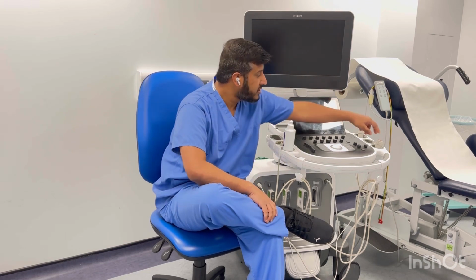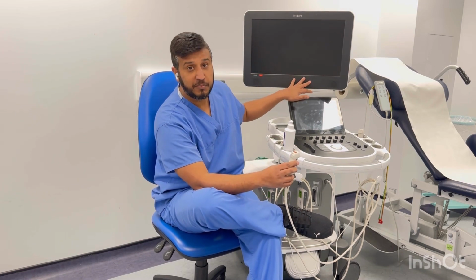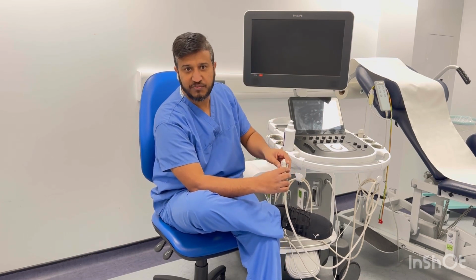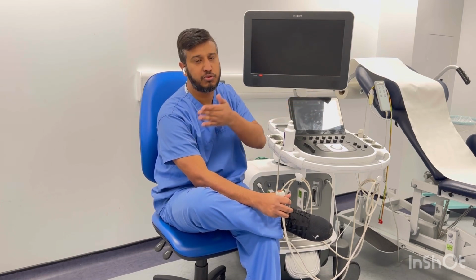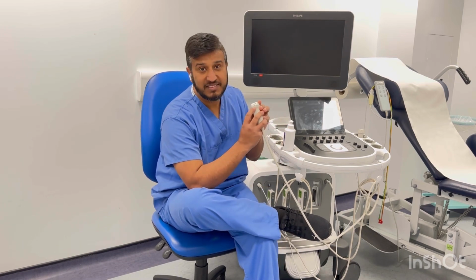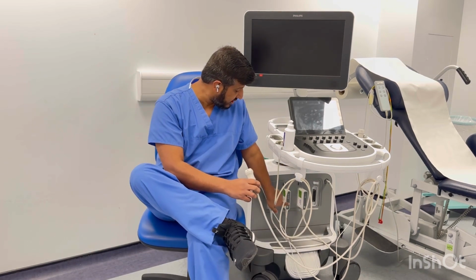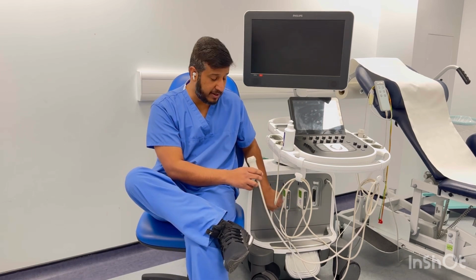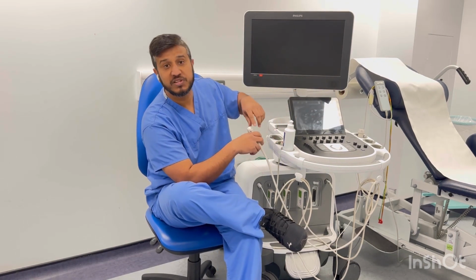If you look at the probes, every probe has something written here. By the way, let me tell you something about the machine. This is a Philips machine, an Epic machine. These are the probes with the Philips, but the basics will be the same. Even if you are using another machine, for example GE, Toshiba or any other, the basics will always remain the same. Every probe has something written on it, even in the other companies. If you don't find anything written there, you can check where the probe is attached and you will find it there. Anyway, this one is written X5, the other one is S9, and this small probe is S12.